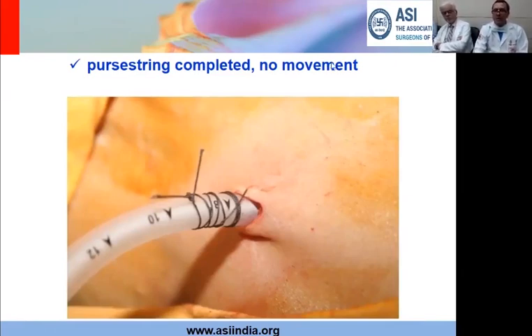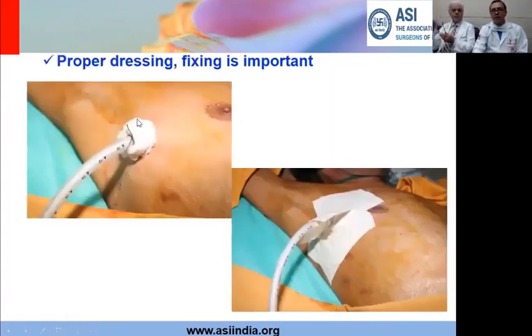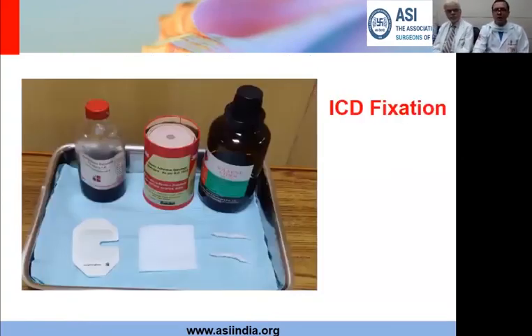Now remember, this is a sterile area, and if you put a dressing like plaster, Gynoplast, whatever, directly, those are not sterile things. So you have to be careful that you put a sterile dressing around it. Earlier, we used to put a gauze piece around it, and over the gauze piece, we used to put the plaster. But many times, this plaster used to come in contact with the area where the tube is entering, and the inside of the plaster is not sterile. So what I do now is to take a little bit of cotton. Many people might object, but this is how I do it.